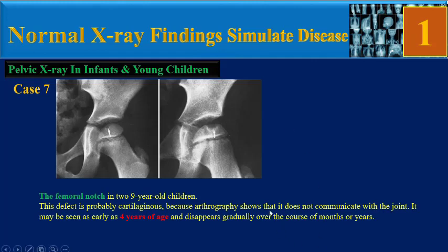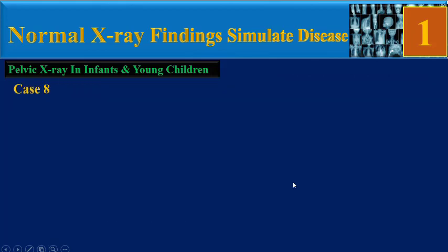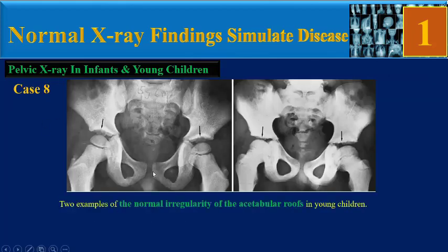Case 7: the femoral notch in two nine-year-old children. This defect is probably cartilaginous because arthrography shows it does not communicate with the joint. It may be seen as early as four years of age and generally resolves over the course of months or years. Another example shows double femoral head notches on the left side in a nine-year-old child.